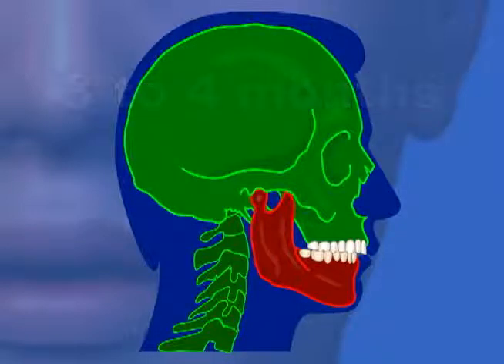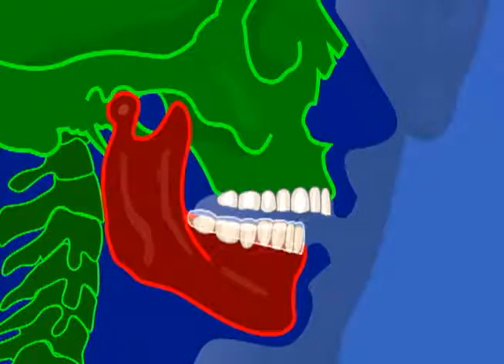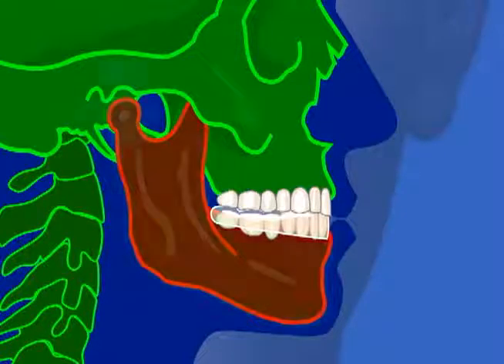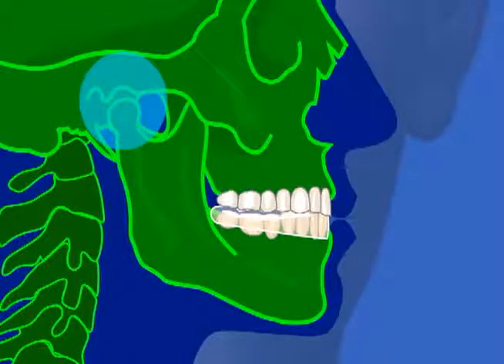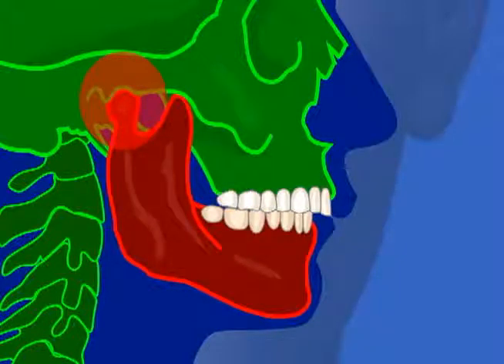After the arch forms have been developed and the upper recessed teeth have been postured forward, one thing that I like to do with chronic jaw pain patients is to fabricate a clear, anatomical, removable appliance that, when worn, will advance the lower jaw to a more forward position when the patient closes down. This decompresses the joint and allows those muscles involved with chewing to relax. This appliance is a great, non-invasive way to determine whether or not the desired changes are occurring. When the appliance is not worn, the patient's bite returns to its original, painful state.